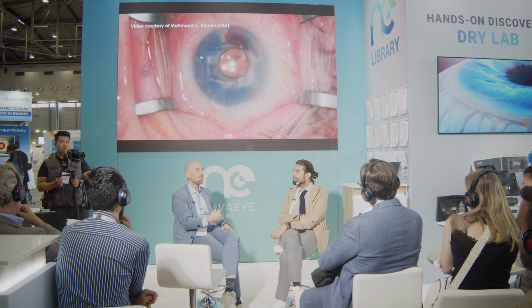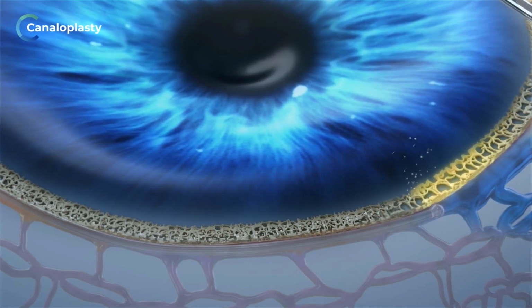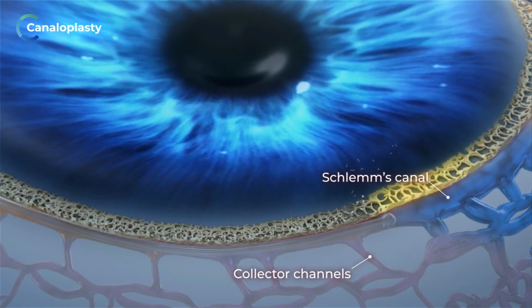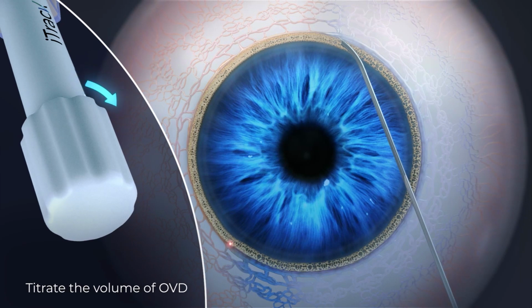We use this illuminated catheter, which gives me the best control to see where I've opened. Is it within the canal? Should I change something? The second thing is I can titrate the amount of viscoelastic and add much more than in any other canal-based procedure. Don't be afraid to push more viscoelastic.